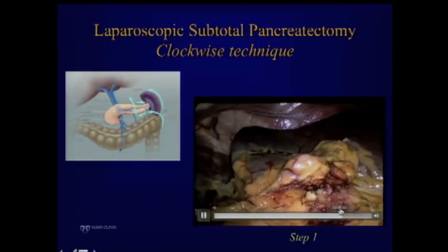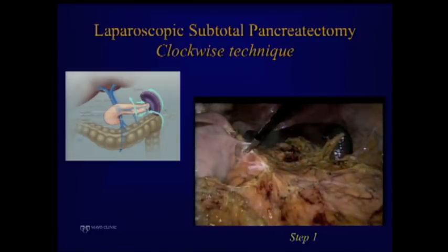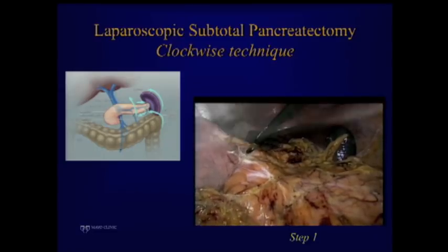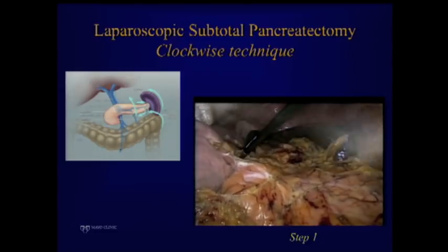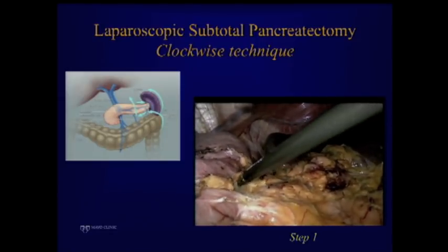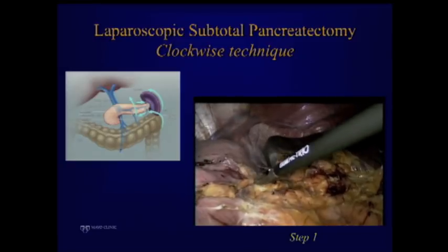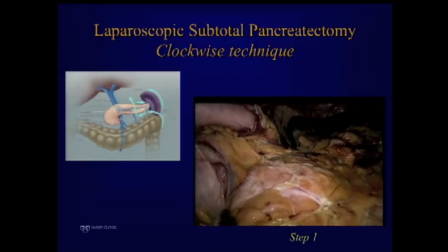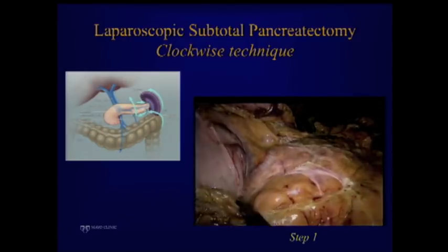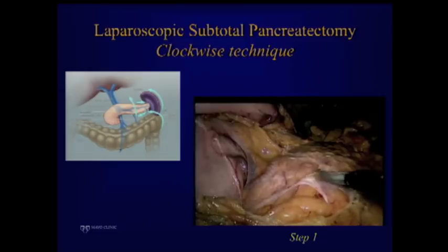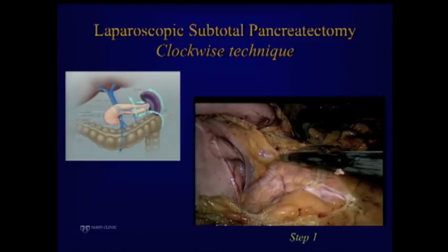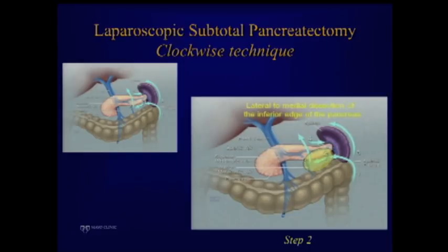Once in the lesser sac, you can continue going up to take down the short gastric vessels — and you see there's no retraction other than gravity. You take down the posterior attachment between the stomach and the pancreas. All of this is the pancreas already exposed — we haven't done anything to the pancreas other than mobilizing the colon. That's why I wanted to spend significant time showing this part. You can see the body and neck of the pancreas here with the whole exposure accomplished just by that.